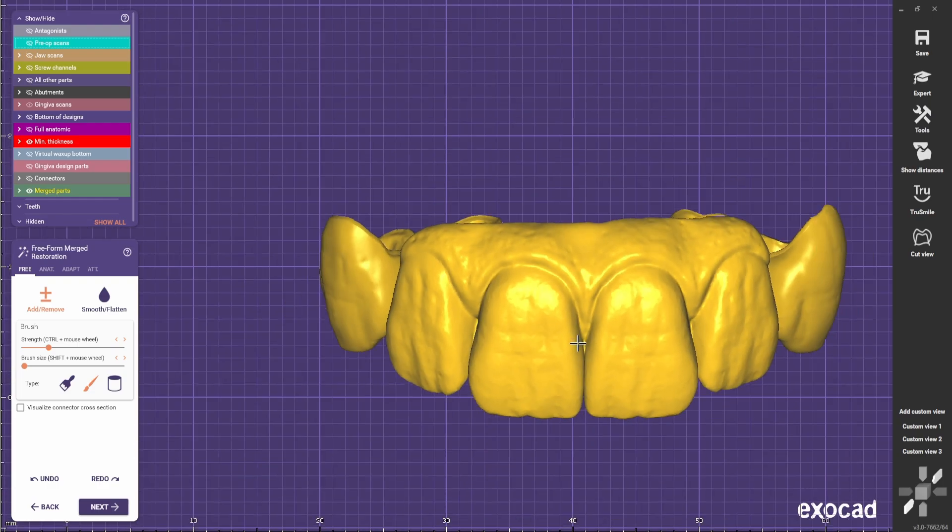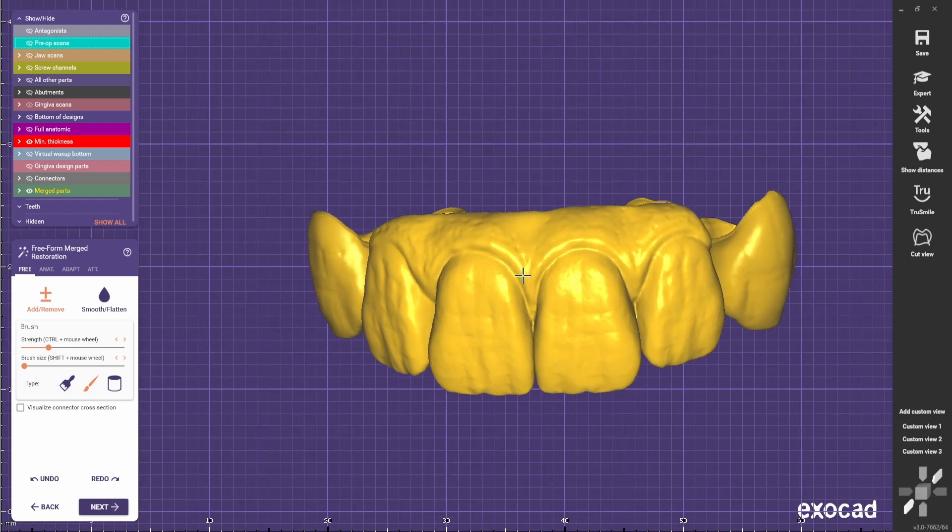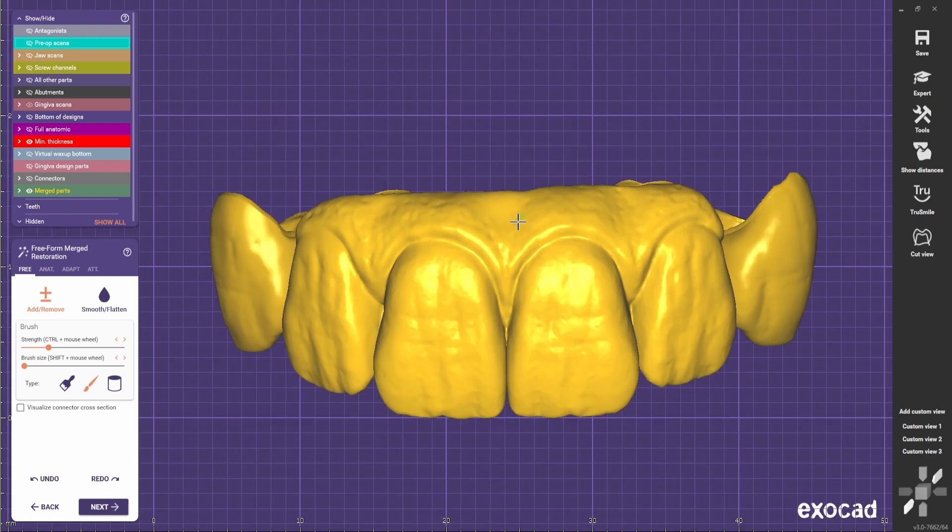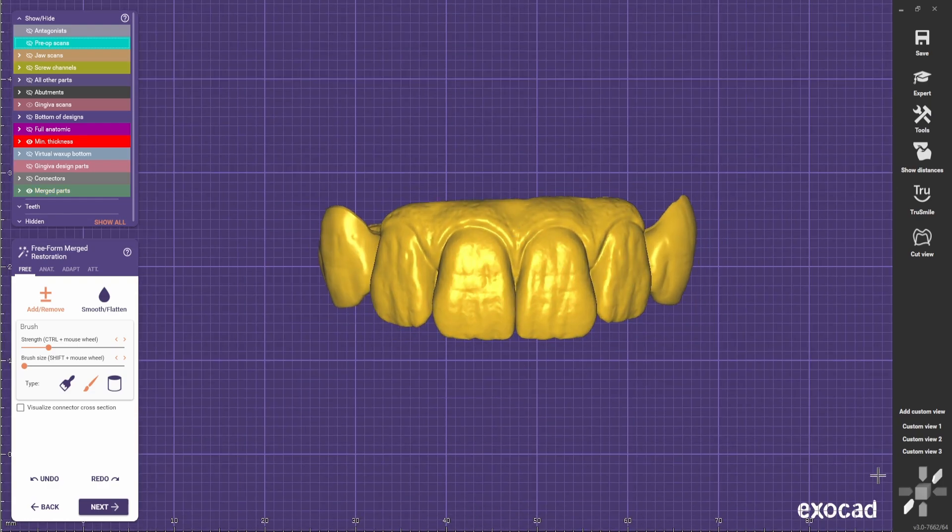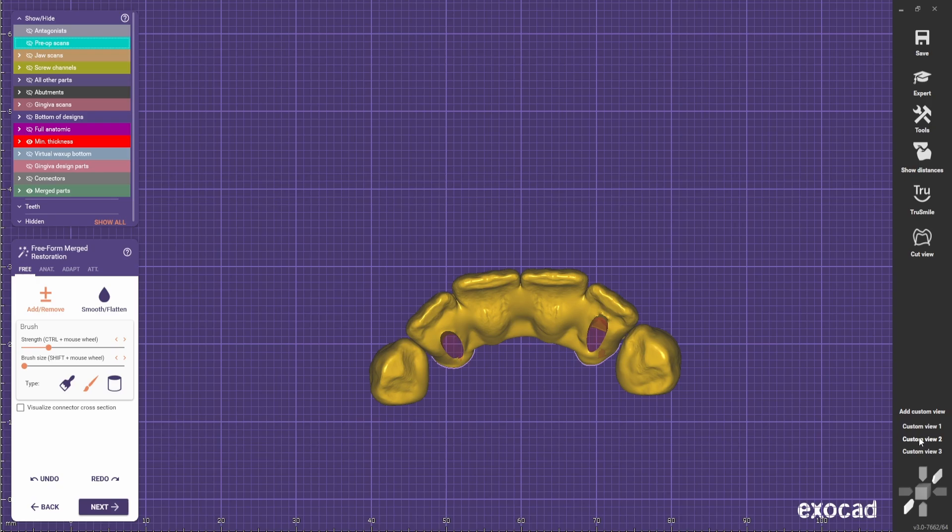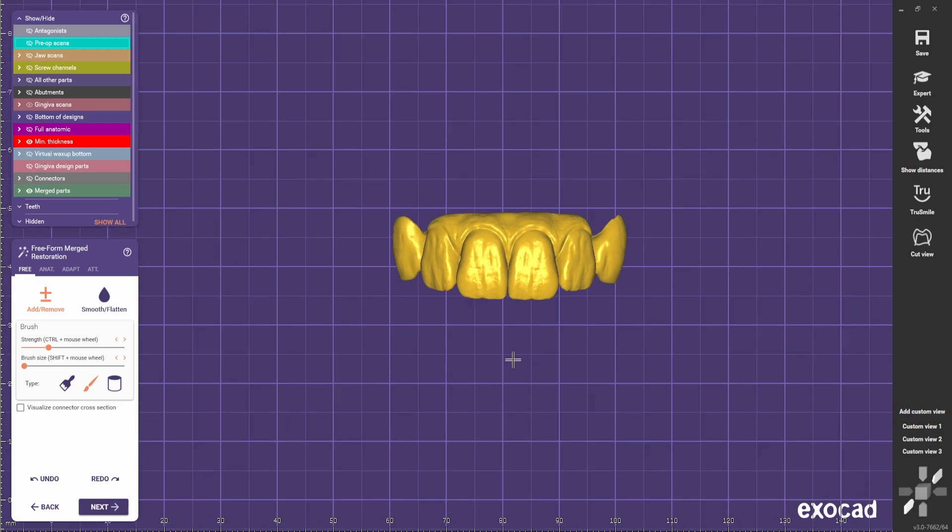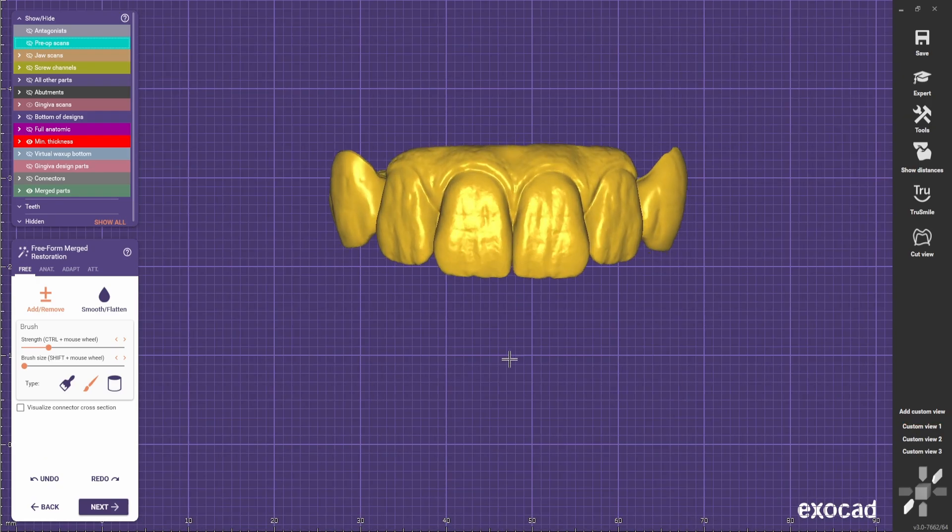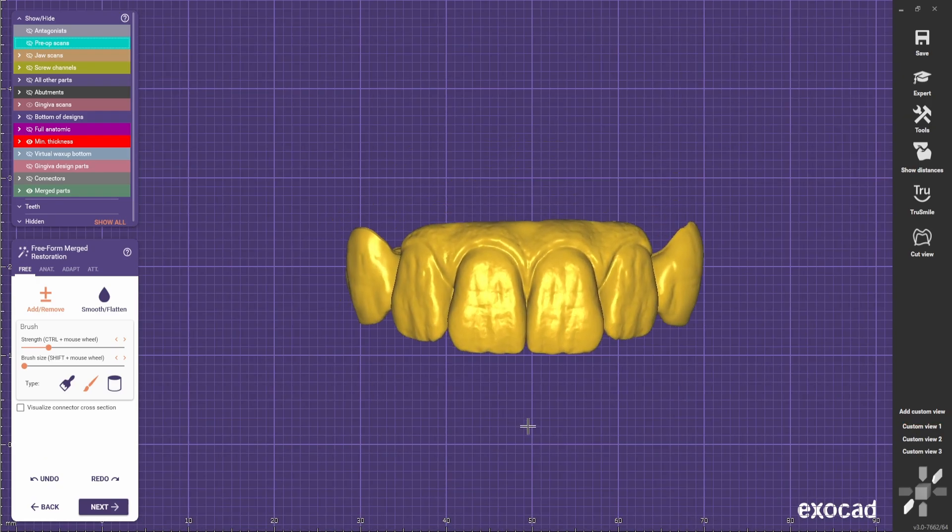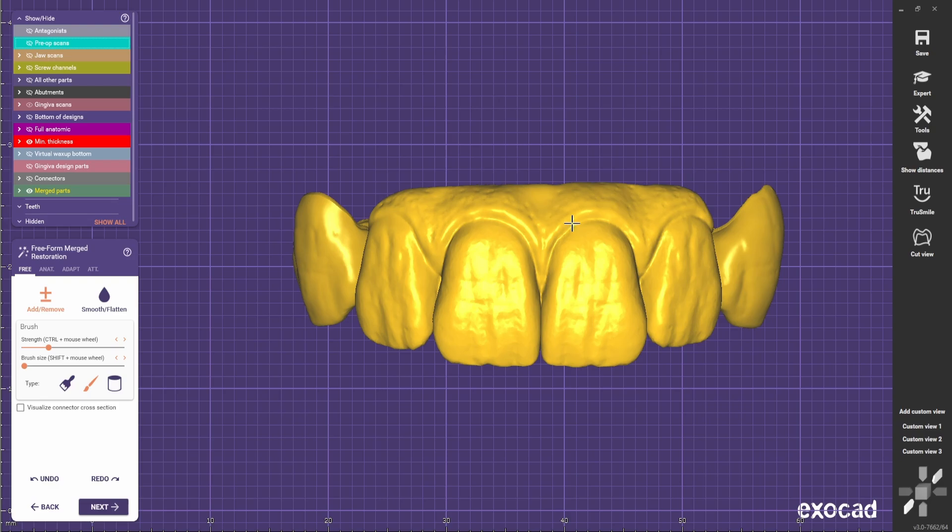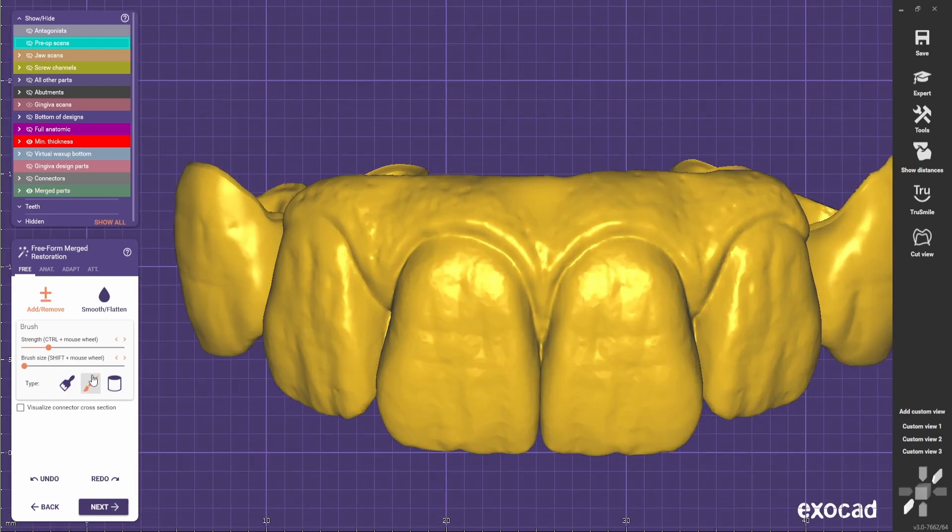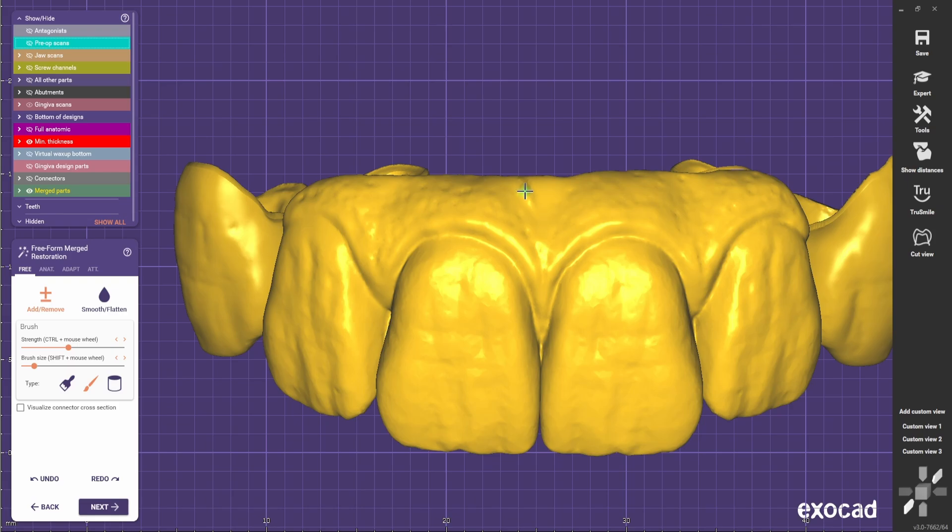So after doing that we do the frenum and it will make the gingiva even more realistic. So we do almost everything with the knife and now we build up a frenum.